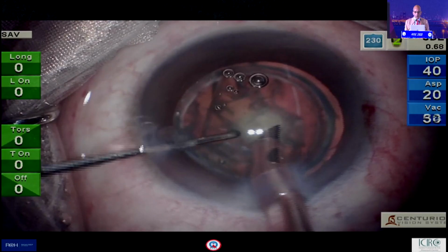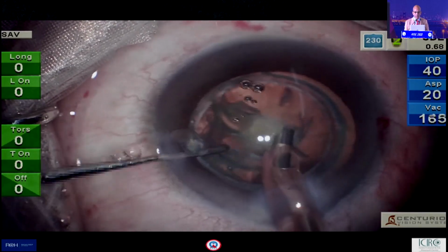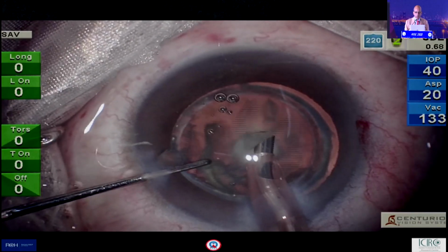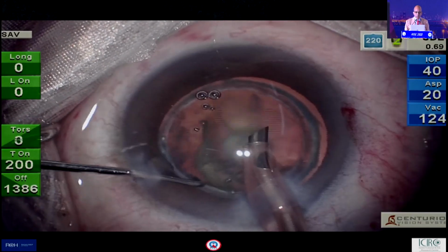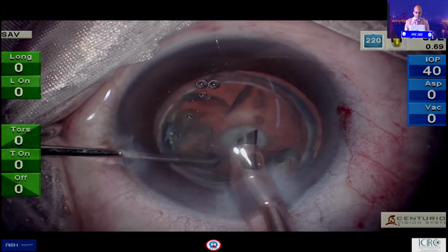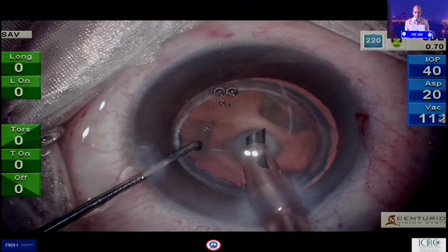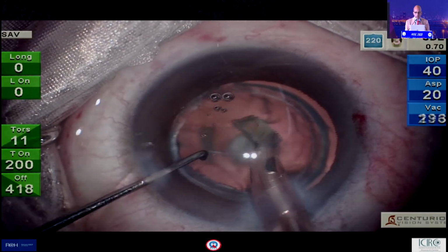Keep the phaco probe right in the middle, do not chase and rotate the nucleus, and it's possible. Now is the time to bring in that communication business: detach the epinucleus a little bit so that the fluid is equally distributed in both compartments.